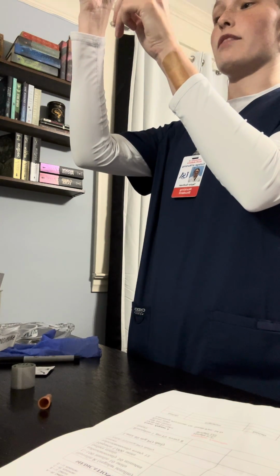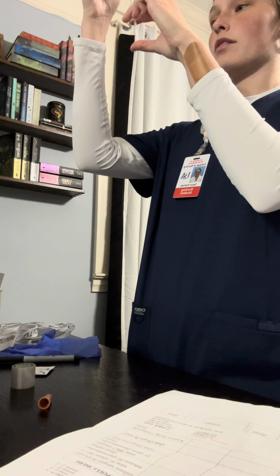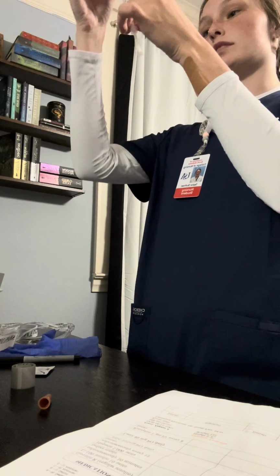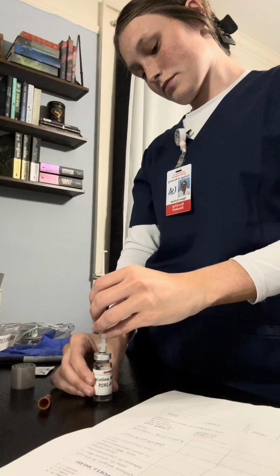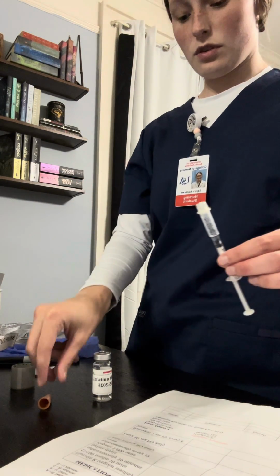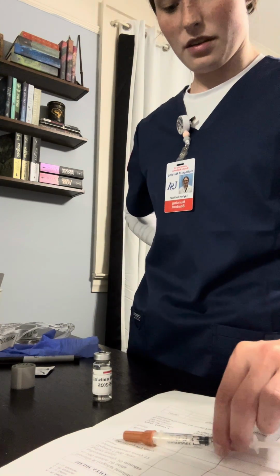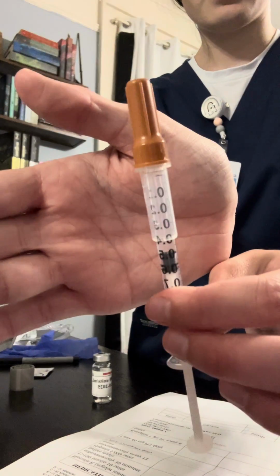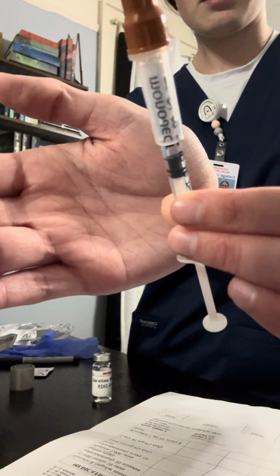Well, my dose is 5,000, but I'm drawing up 0.5. And I don't see any air bubbles. So now I'm just going to take my cap, hand behind my back, just to show that it's 0.5.